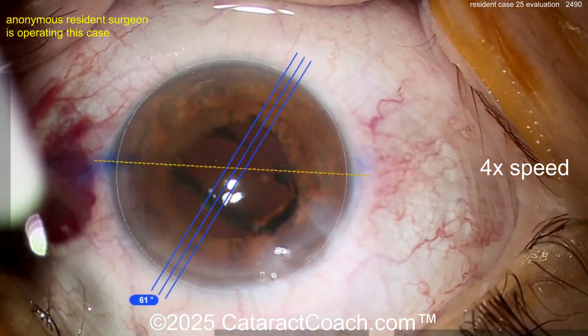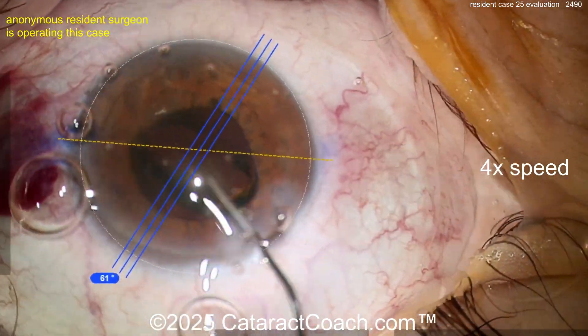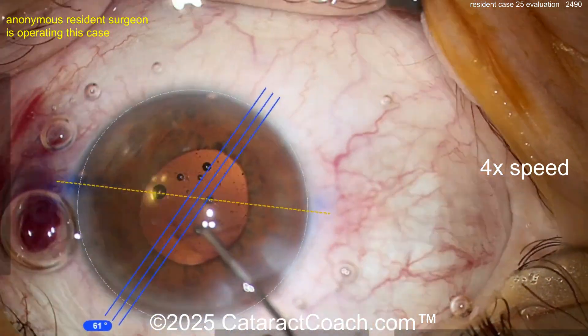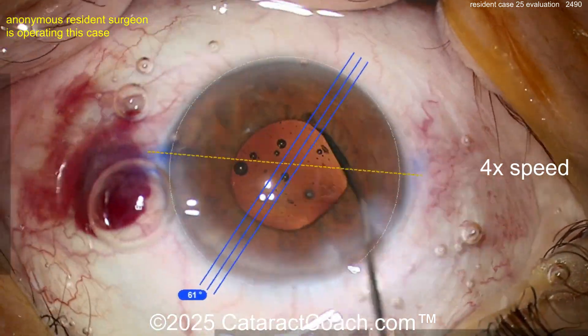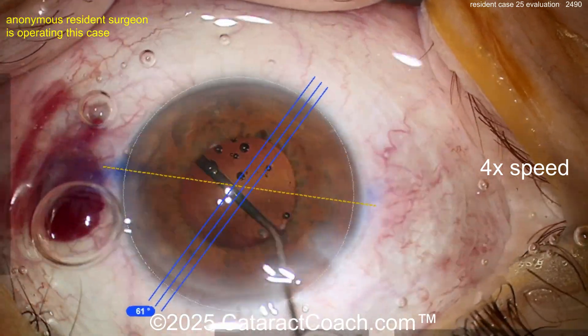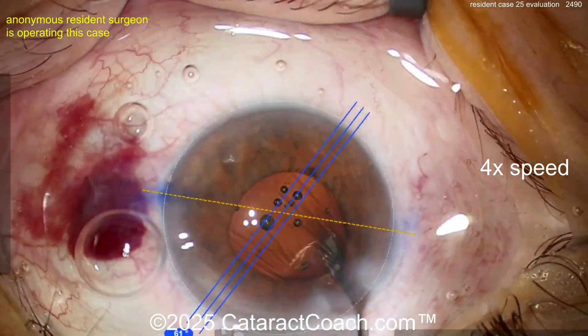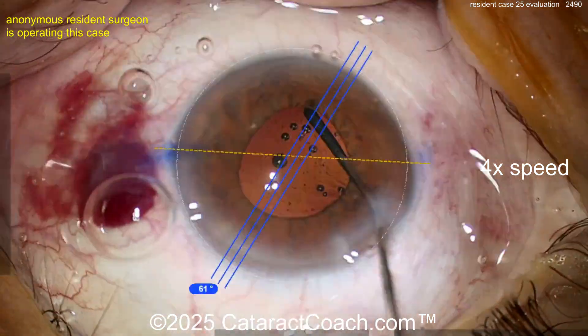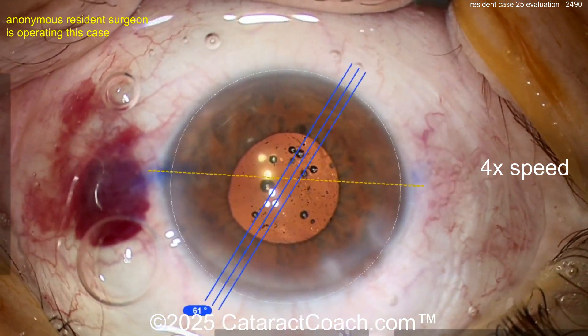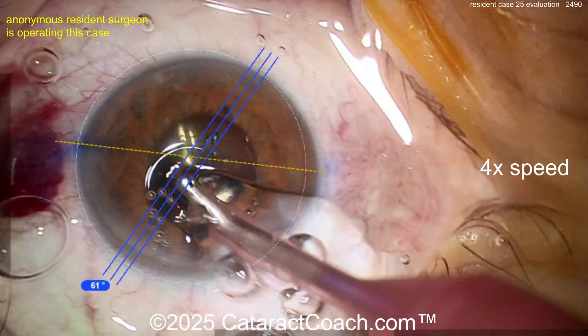Be careful, get that lens in the bag. Now let's get it rotated. It came down a little bit — is it a toric lens? Are you trying to get it rotated to the correct meridian? You've also got to remove the viscoelastic. Use both hands inside the eye — it's going to make life a lot easier.